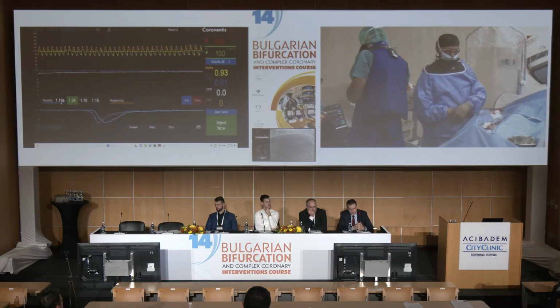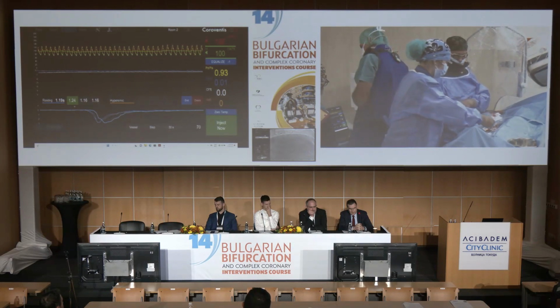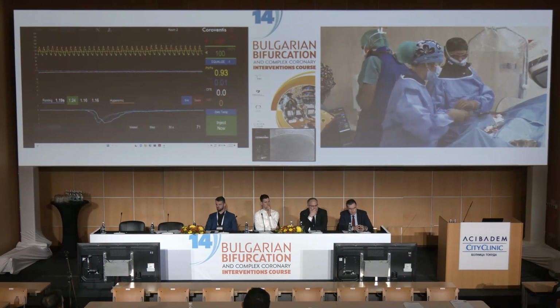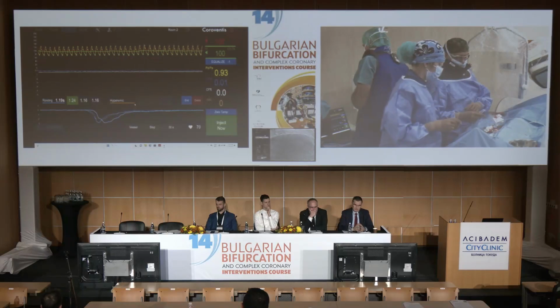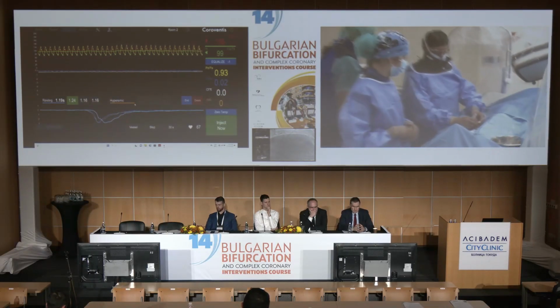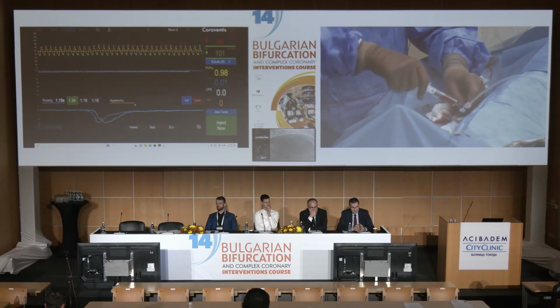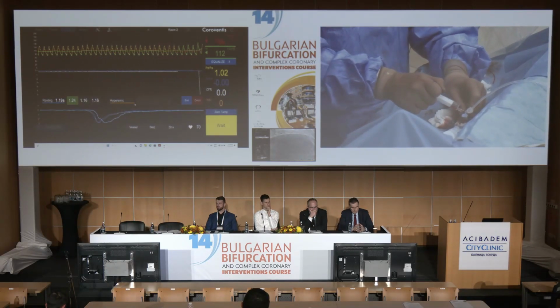And this is the reason why we are going to do that at rest. This is at rest. These values are relatively long. And we are going to now induce hyperemia. So I let you do. Okay, you can induce hyperemia. Please go. And we are going to induce hyperemia again with papaverine.